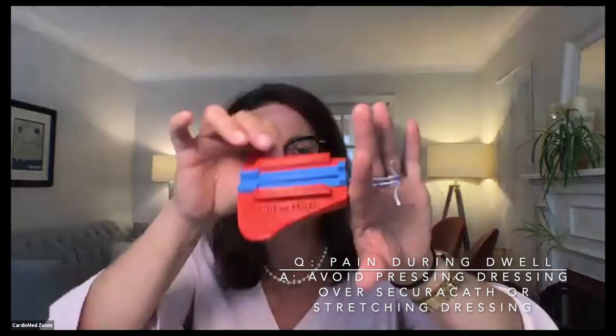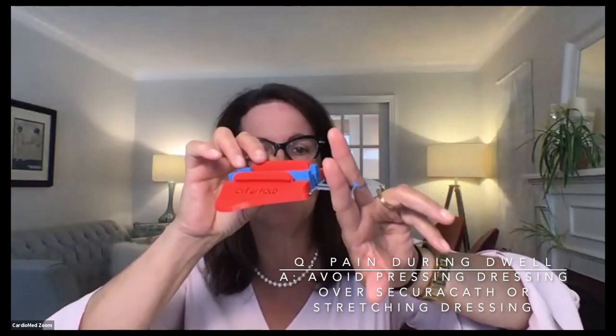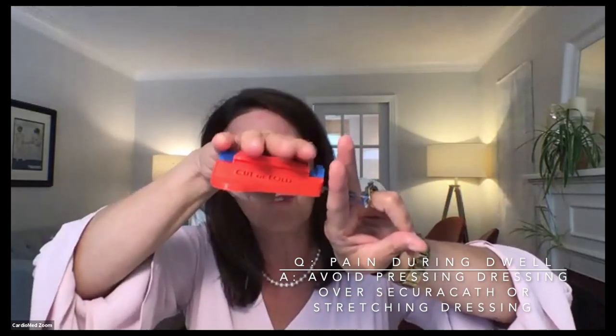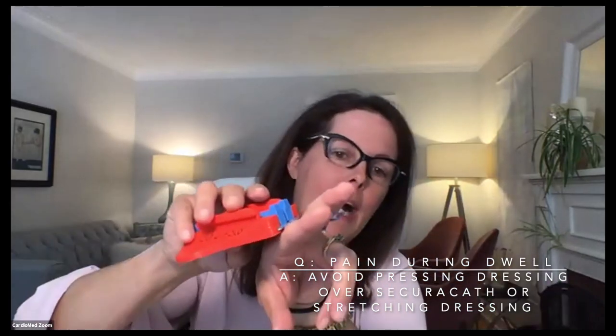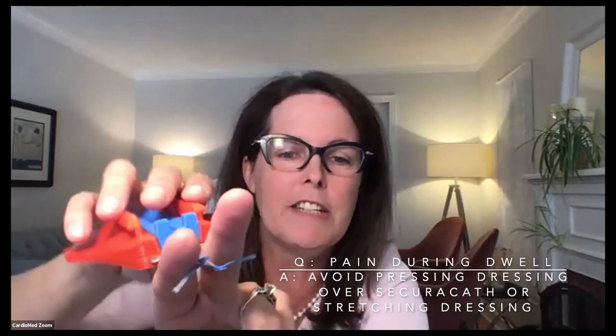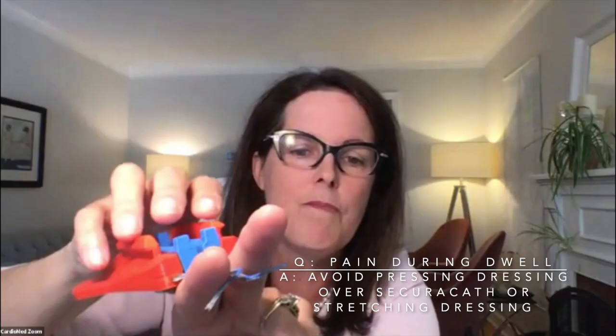I was just in a cancer center doing some in-servicing this past week, and they had a patient come in who had been complaining of pain since the previous day. What the nurse discovered, fortunately having just been at the in-servicing the day before, was that the previous nurse, because there was a little bit of bleeding, had applied a compressive dressing on the SecurAcath. And so what happens, this is just my Jumbotron version, is that we should have the feet in fairly deep down in the subcutaneous tissue. But if the SecurAcath is pressed down, if that dressing is too tight, it pushes the feet up against the skin much more superficially rather than in the deep subcutaneous tissue. So that will cause some pain. And as soon as that nurse removed that dressing, the patient said, oh my goodness, I have no pain.